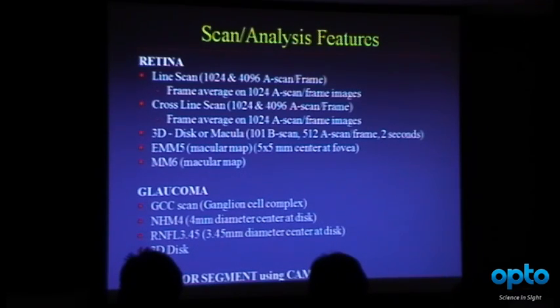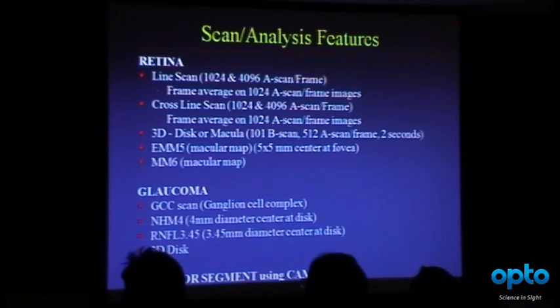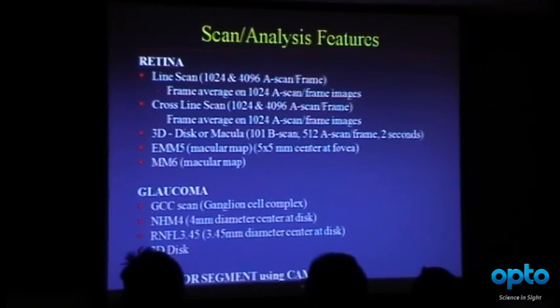Now, sometimes this gets confusing. You see all these retina protocols, and you say, which one do I choose? I can tell you what I like to use, but there are advantages to each. And sometimes we sacrifice accuracy for speed. And some of these protocols are better for patients who just can't fixate for very long.